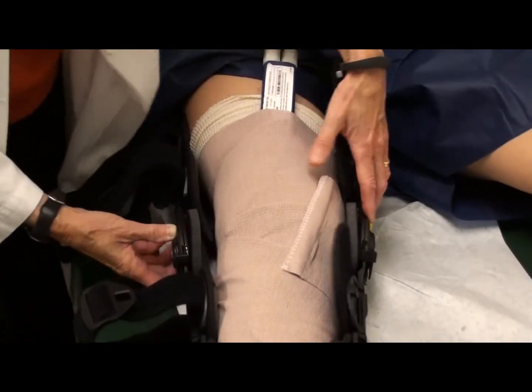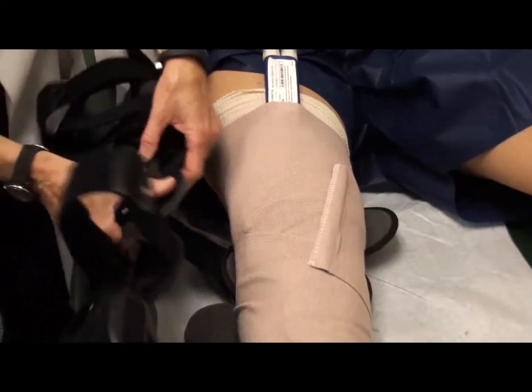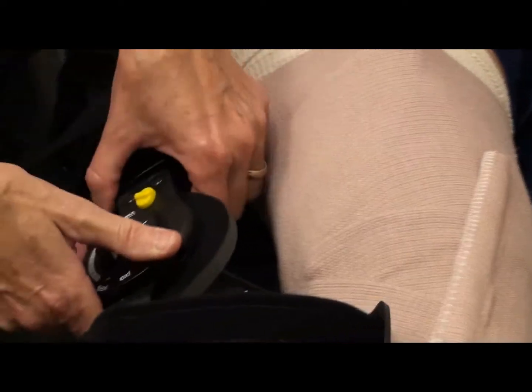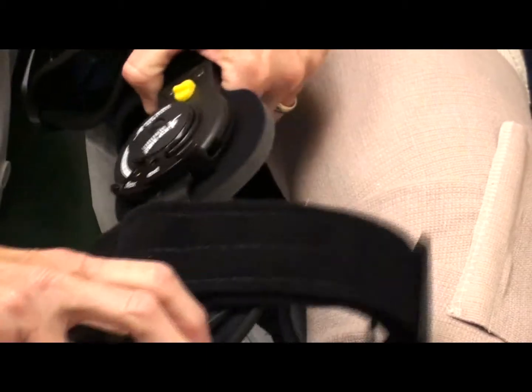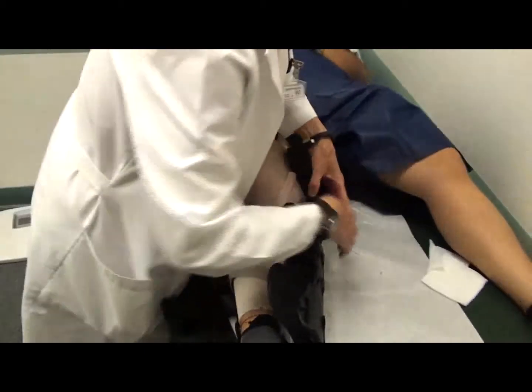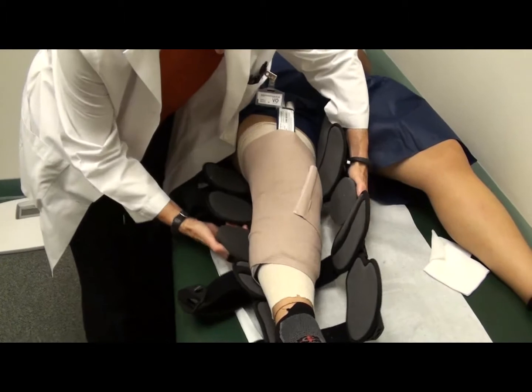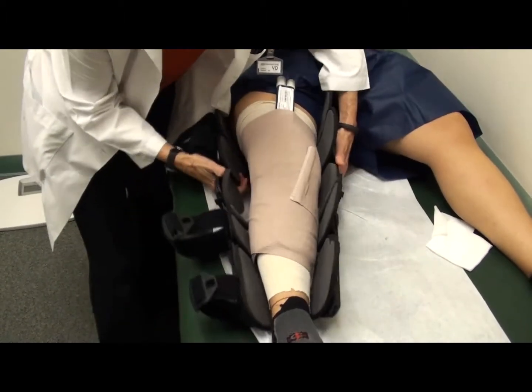You line that up, and if you need to, I will show you a secret about these braces. This little yellow tab here you can pull up, and voila, the brace will bend. And it's a little easier to put it on if you want to do that. I prefer you don't do this until you come back to the office the first week. But if you have to, you can.